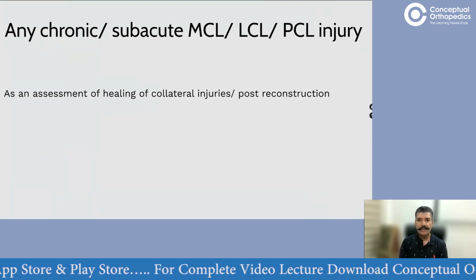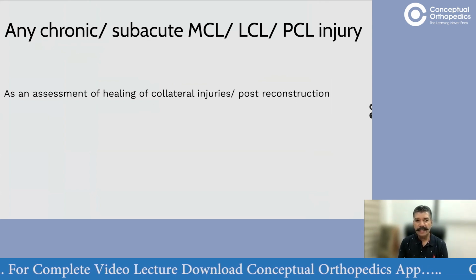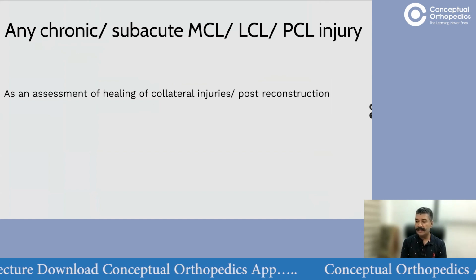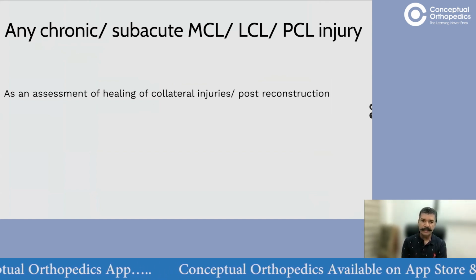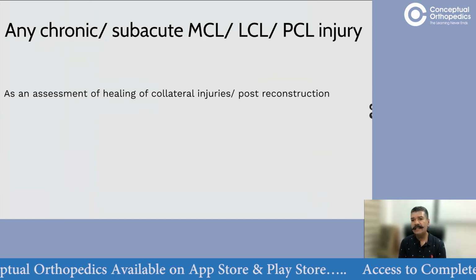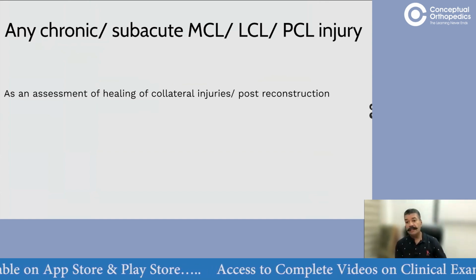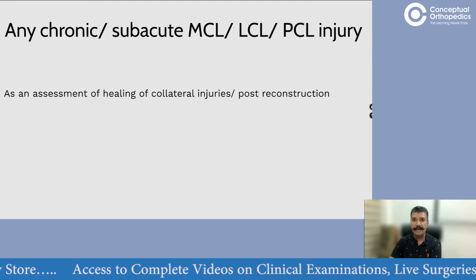So the indications to get a stress X-ray in your practice is basically any chronic or subacute MCL, LCL, or PCL injury. I also use it in acute injuries. So I use it as a method of assessment of healing of collateral injuries, particularly in high-performing individuals. Let's say if an athlete comes to you with a ligament injury of the knee, I hope you're all aware that the commonest ligament injury of the knee is the injury of the medial collateral ligament.